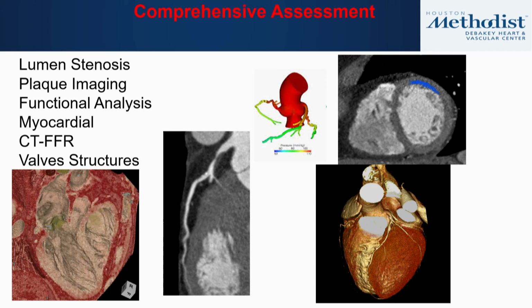I take it for granted right now, but bottom line is CTA is a very powerful anatomic technique which allows you to look at the lumen stenosis, can do the plaque imaging, functional analysis, myocardial assessment, CTFFR, valve structure. Some of them CT does very well. Some of them has a secondary or tertiary role because other technology can do it better.